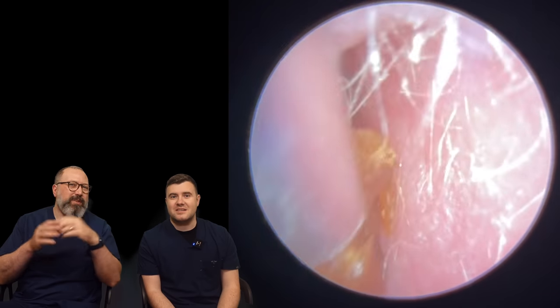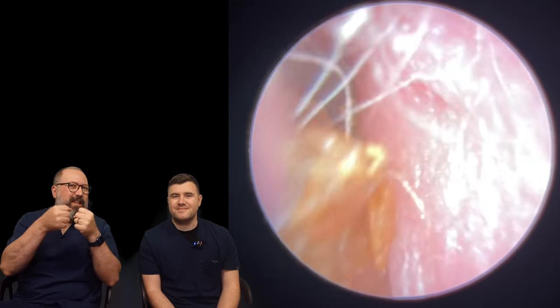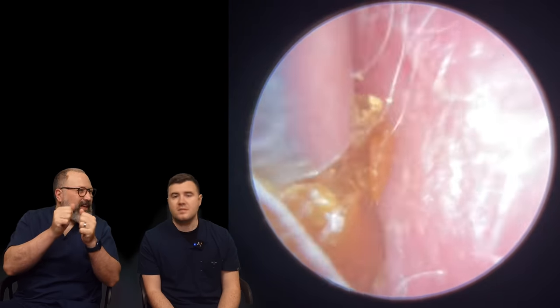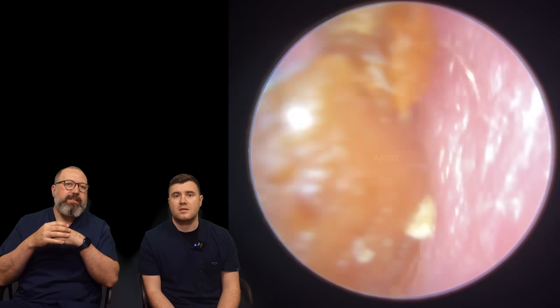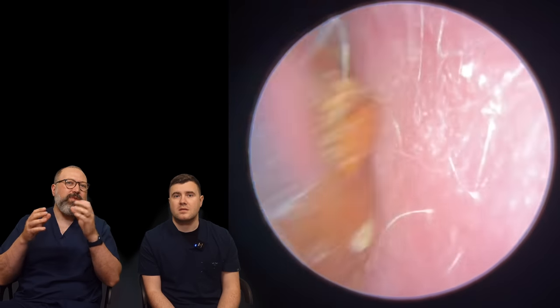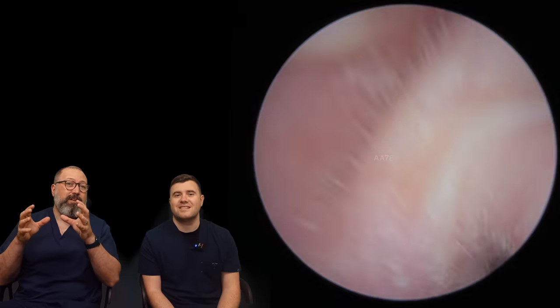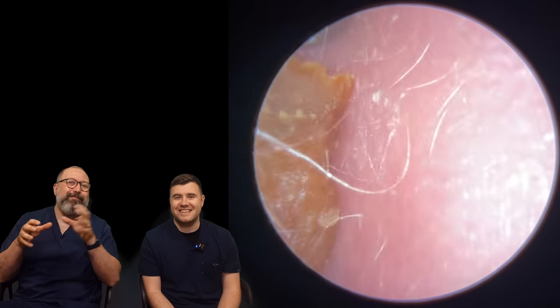It tends to be as we get a little bit older that skin loses a bit of elasticity, so it does get more floppy at the entrance sometimes. But this is coming around to sort of fight it — not because the wax is hanging on in there, but basically because the plug of wax is just a bit too big and you can't get through the gap.